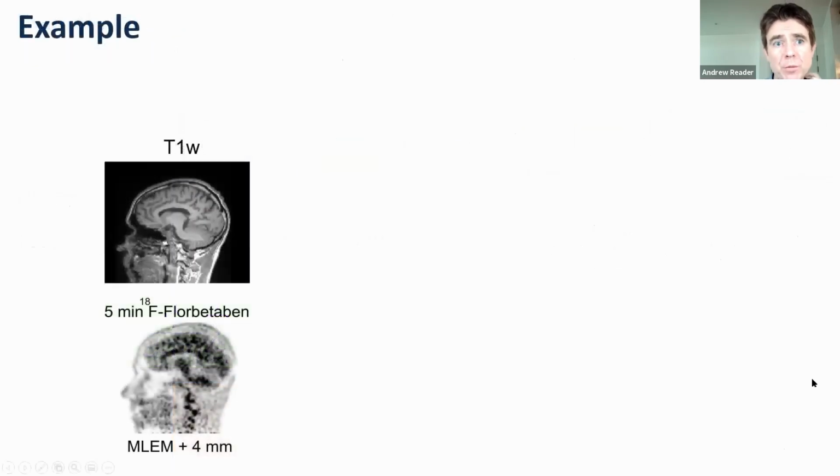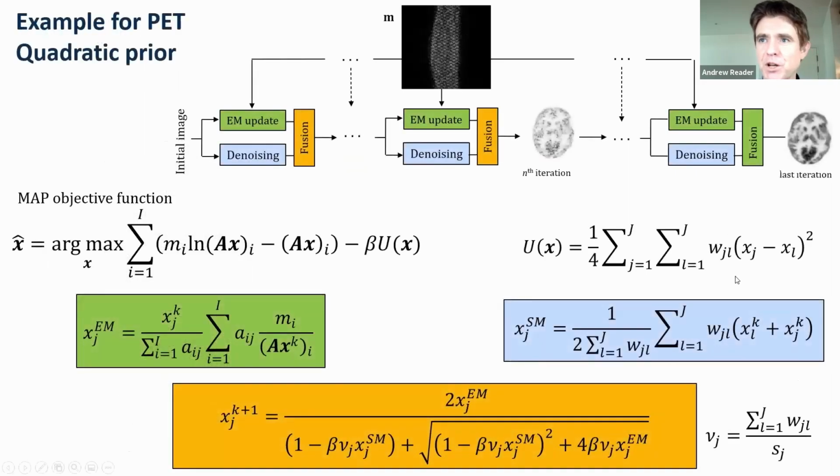So the kind of results that you'd get from that, unfortunately, I'm going to show it here for MR guidance. Sorry about getting ahead of myself. To explain, this W, not only can you use it like a Gaussian kernel that would say, okay, if things are far apart, then we'll allow them to be different, but if they're close, then differences matter. But you could also plug in MR guidance information here, in which case you've got a spatially variant guided smoothing process, and that's what I'll be showing in the next slide, and also what you'll be covering next week in more detail. But as a special case in the next slide, I will be showing you where effectively I'm not using much MR guidance. So let me show you that.